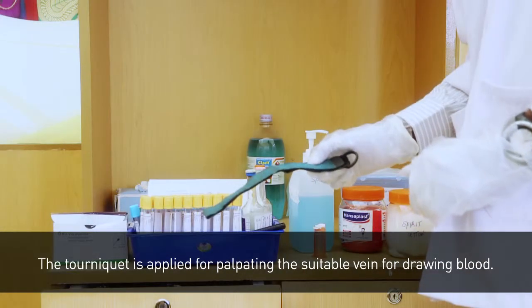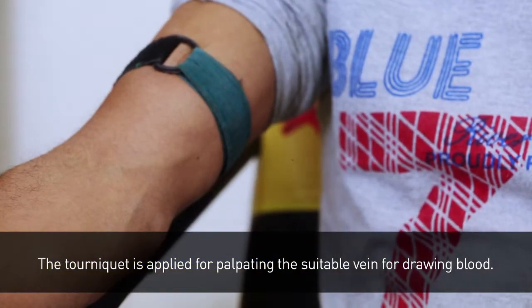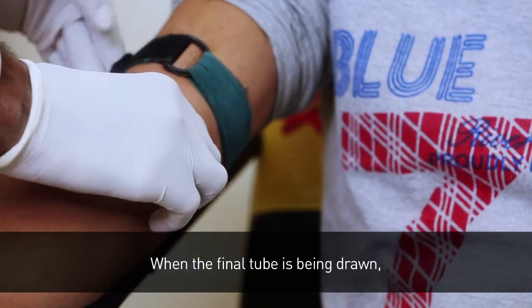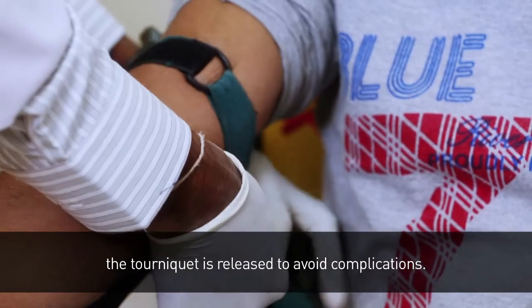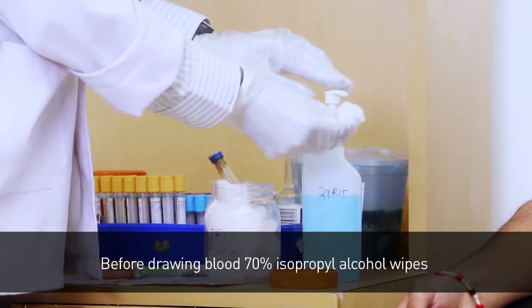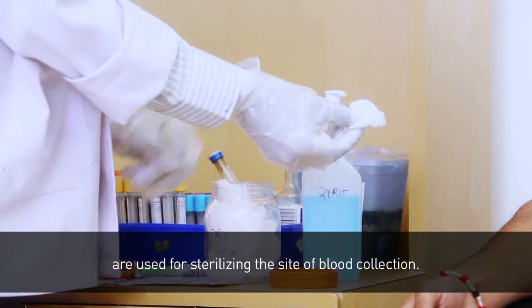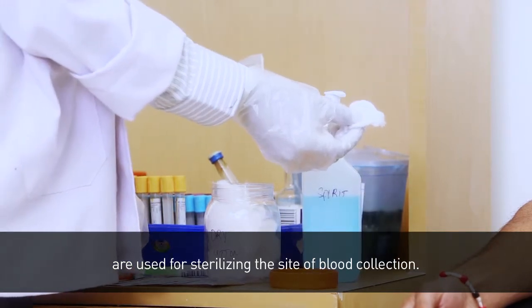The tourniquet is applied for palpating a suitable vein for drawing blood. When the final tube is being drawn, the tourniquet is released to avoid complications. Before drawing blood, 70% isopropyl alcohol wipes are used for sterilizing the site of blood collection.